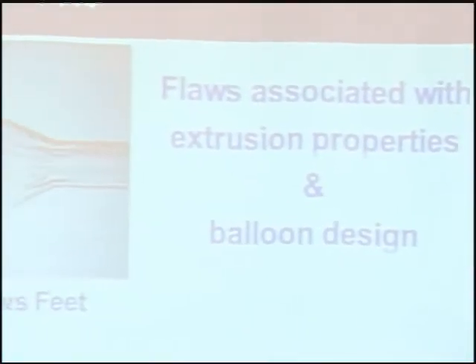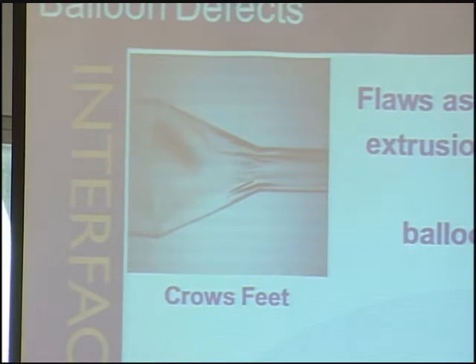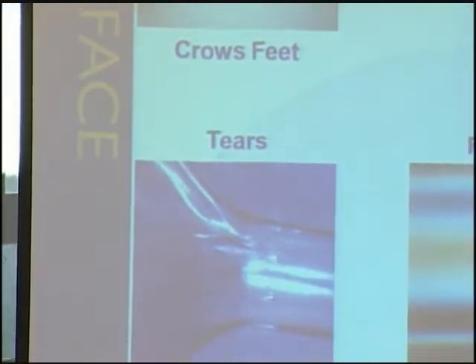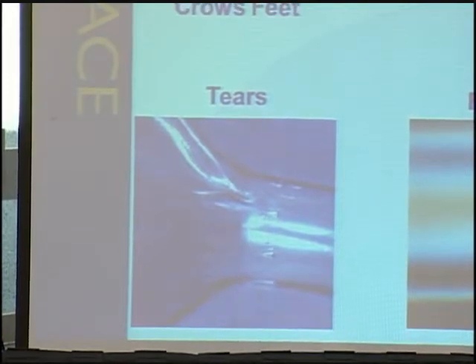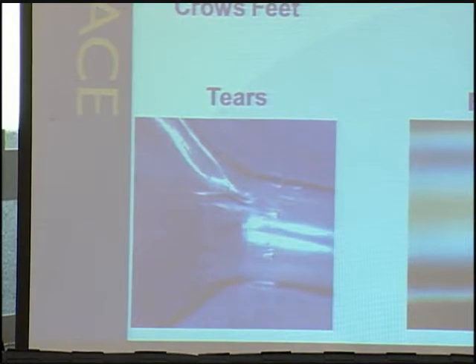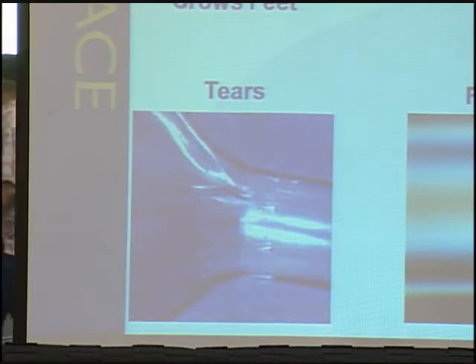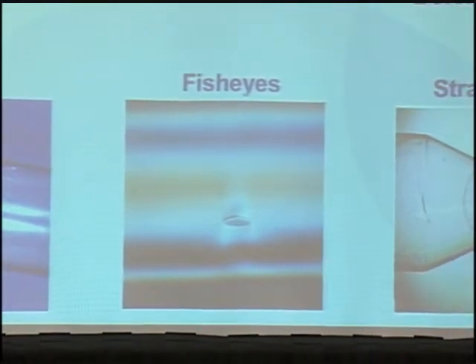And some of the balloon defects that are related to these variables, especially in the extrusion: you've got crow's feet on the top left, which is just a material buildup in the cone, which will affect your folding profile and your IDs and ODs of your balloon. And then the tears. What happens there is that you have balloon forming parameters that you set when you develop the balloon, and then the next lot of tubing comes in and you find that you're getting tears on the tails, which is causing radial bursts or tearing during your bonding process. And this is directly related to the elongation of your extrusion. And then your fish eyes can be from your expansion ratios being off, stretching too much, or temperature being too low.